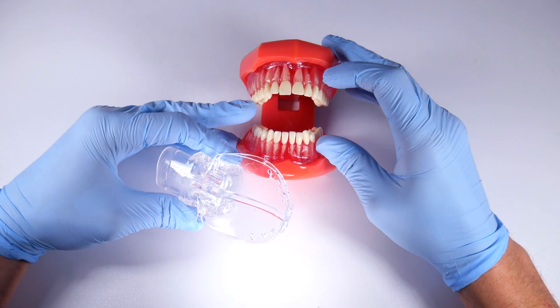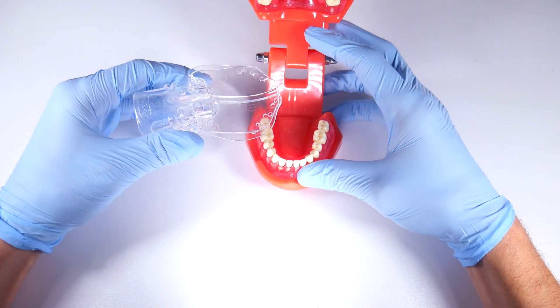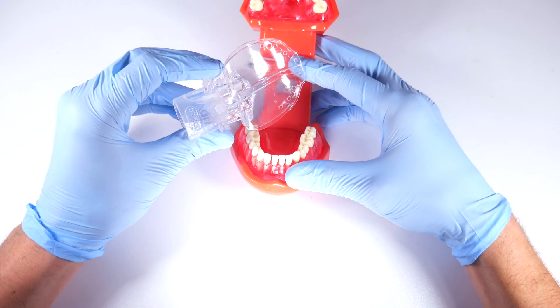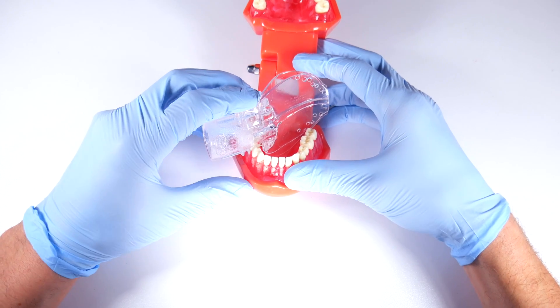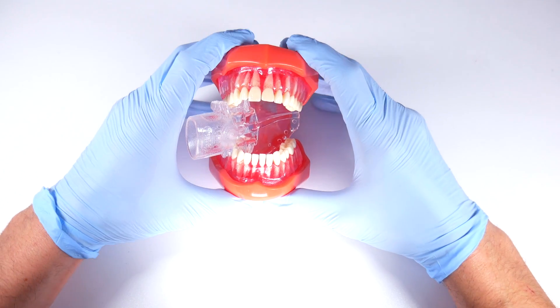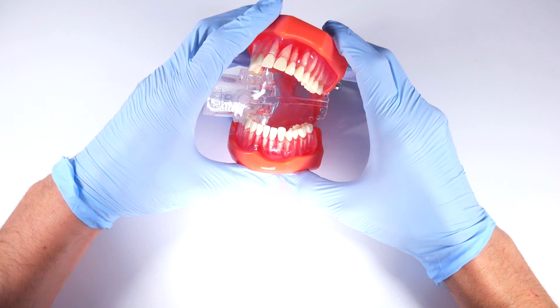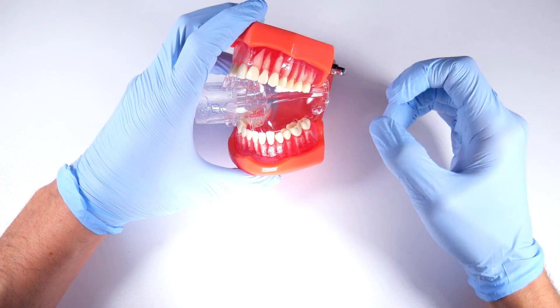Looking at how you put it in — you have to imagine the patient has a tongue, which they don't here in this demo. You just put it in like a regular bite block and have the patient close down on it. You can trim it up and there are all different sizes, but essentially you get a very nice barrier.